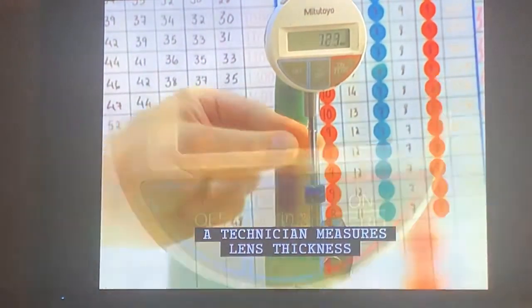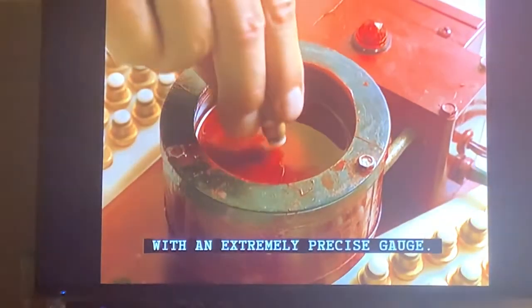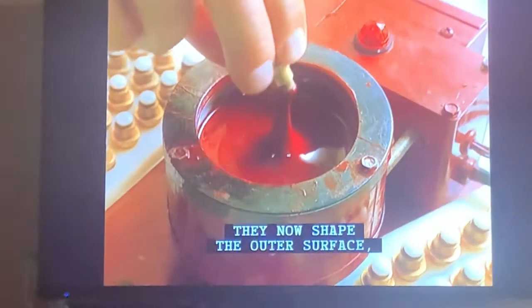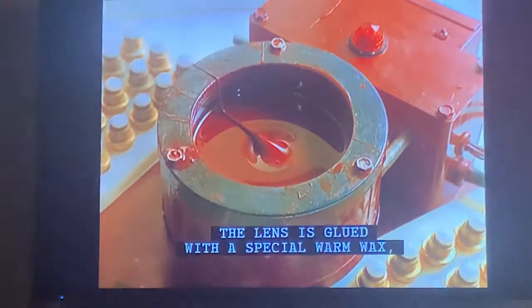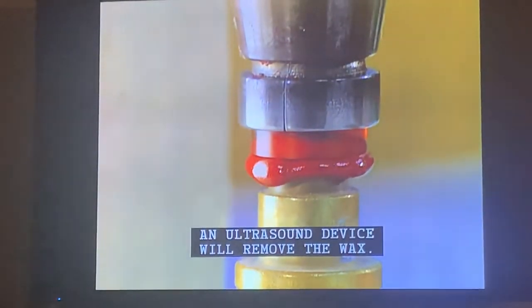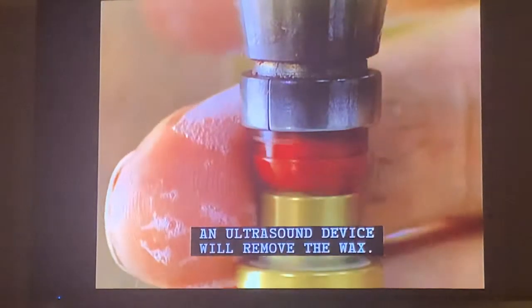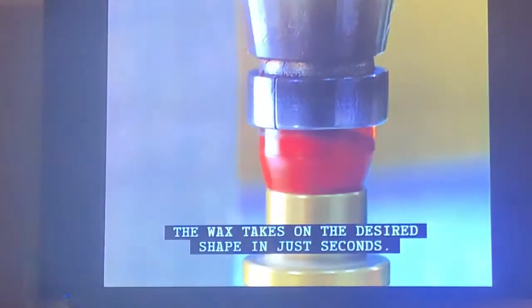A technician measures lens thickness with an extremely precise gauge. They now shape the outer surface — the part that touches the eyelid. The lens is glued with a special warm wax, and when the lens is completed, an ultrasound device will remove the wax. The wax takes on the desired shape in just seconds.